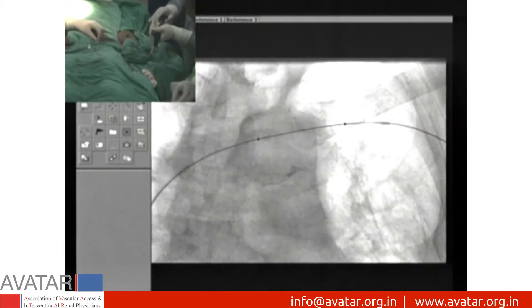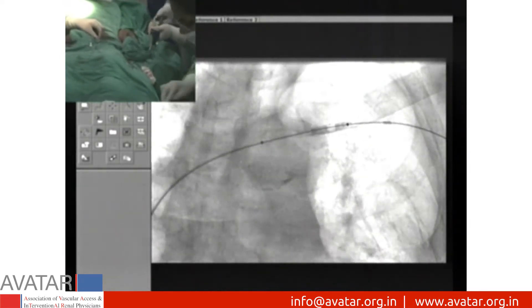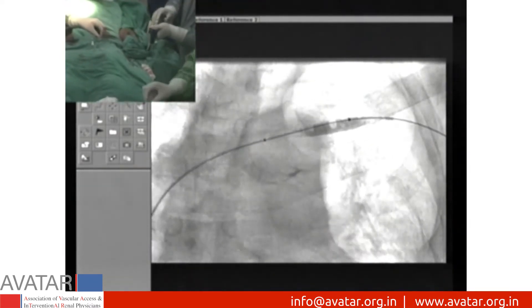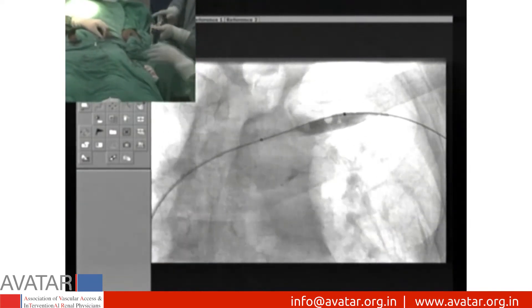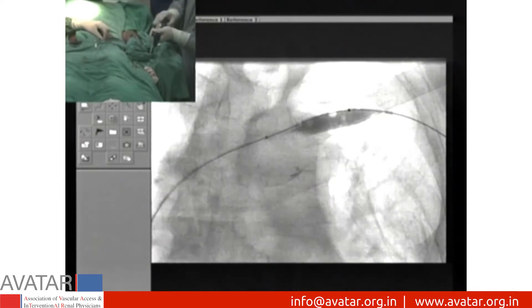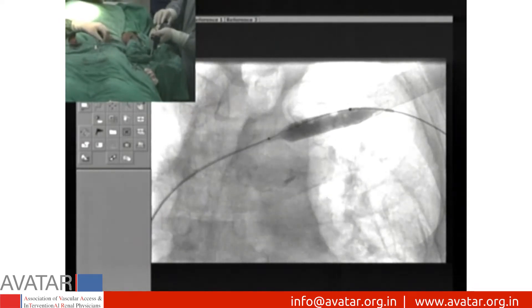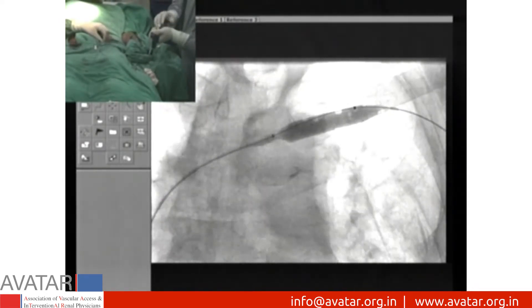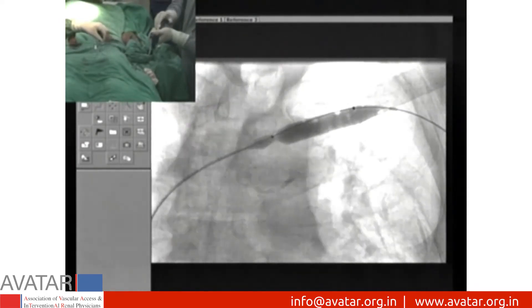Balloon angioplasty is subsequently performed with a 10 x 30 mm balloon and we get good end results following the procedure.